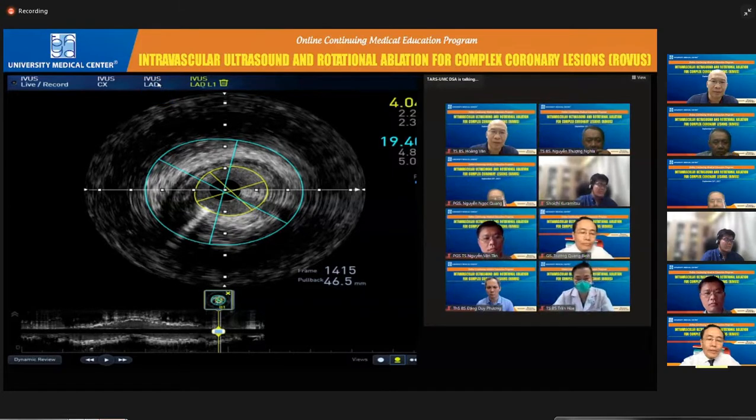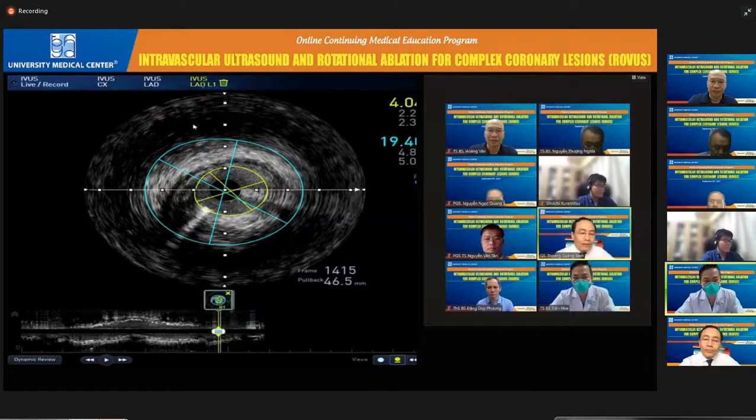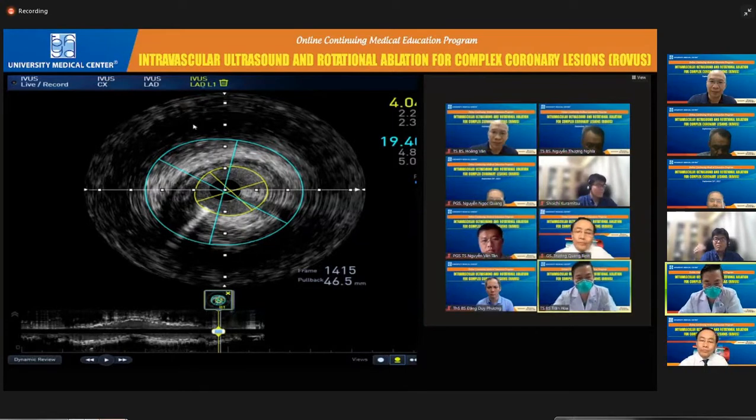Thank you, Dr. Wu. So, Dr. Trần Hoa, what do you think about the strategy for this case? You can choose which technique, one stent or two stents, etc. I think this is a very interesting case.